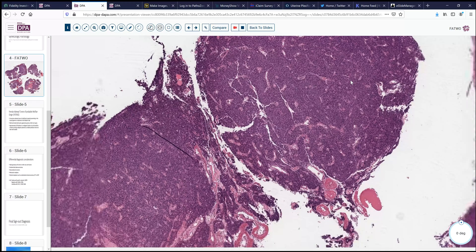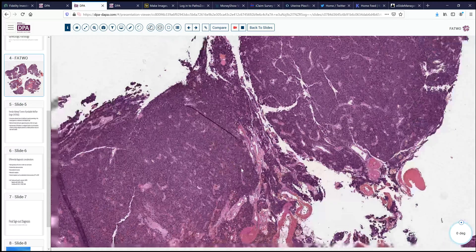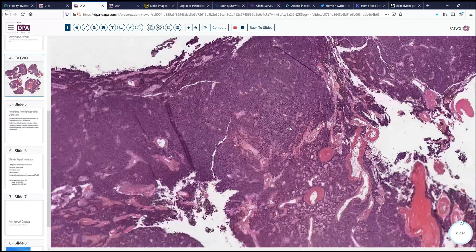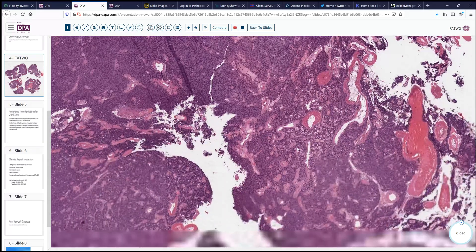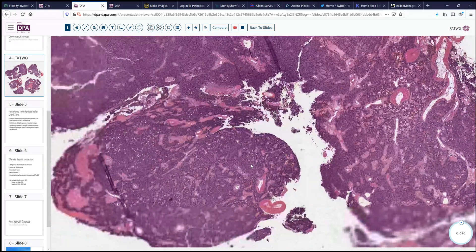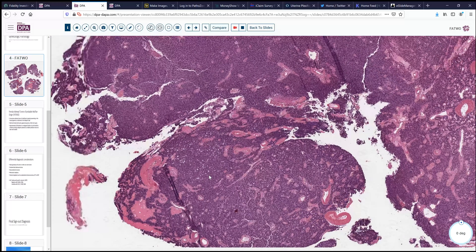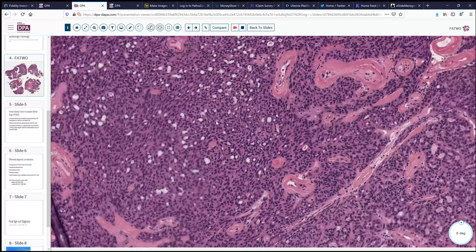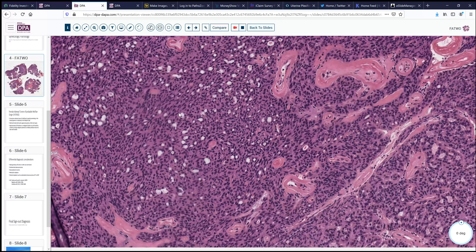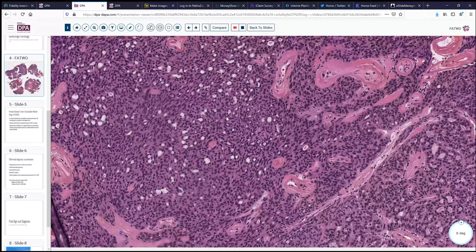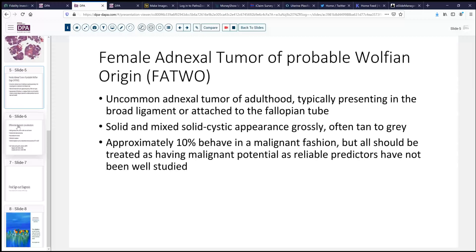It did stain positively with pancytokeratin and had sort of a patchy, weak Pax8 positivity, indicating that it was most likely primary in this location rather than a metastatic tumor from some other location. Stromal stains like CD117 were also performed, with only little focal positivity for CD117 and CD99 — nothing sufficient to suggest a GI stromal tumor or other small blue cell neoplasm. It was also hormone positive with ER and PR.